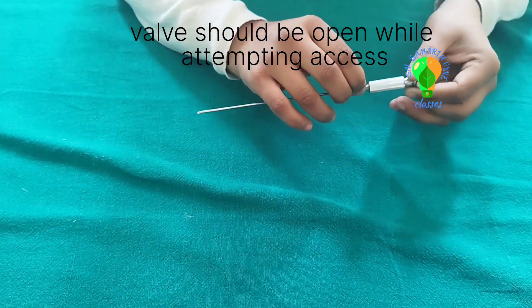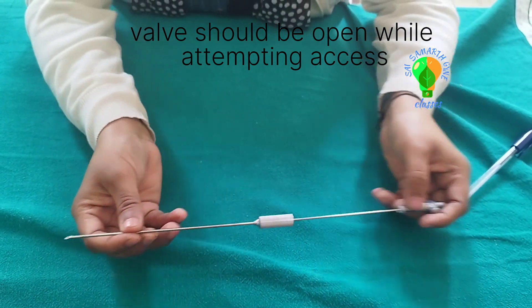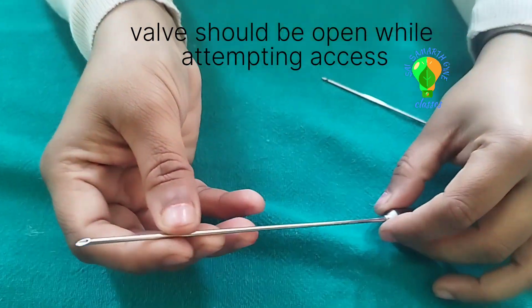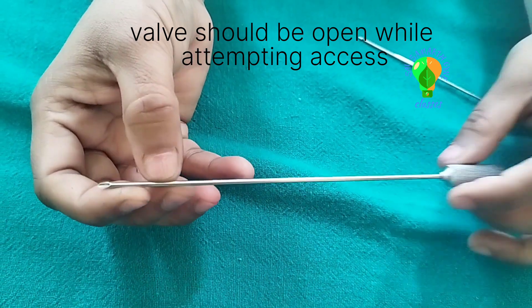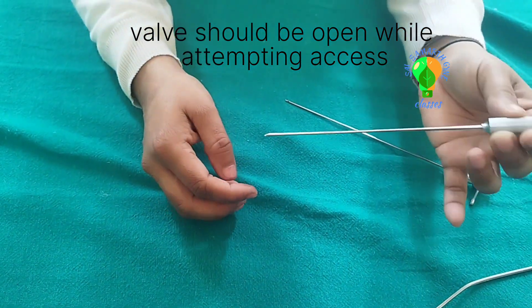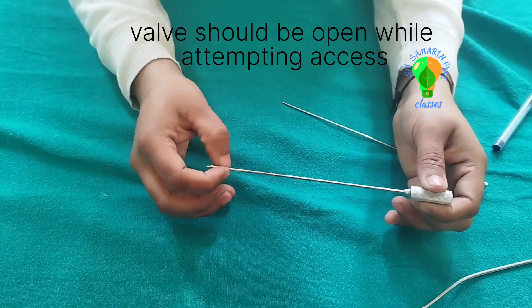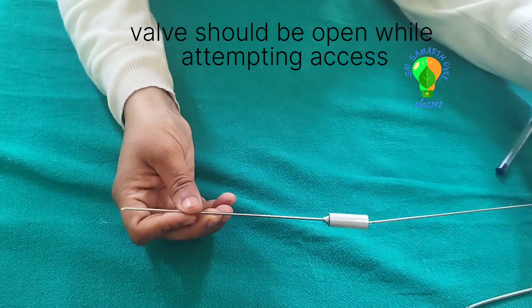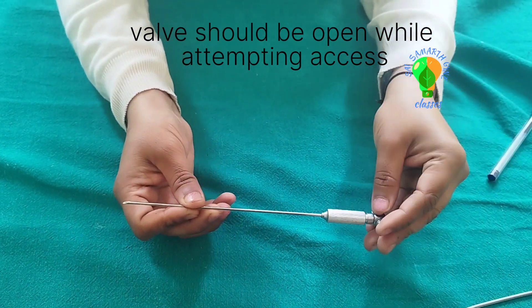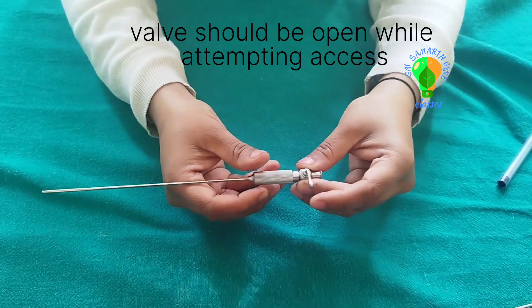When there is resistance during entry, because this is a very sharp tip, the sharp tip will come out only when there is resistance. When you reach the inside of the peritoneal cavity and resistance is gone, the blunt tip will come out pushed by the spring.